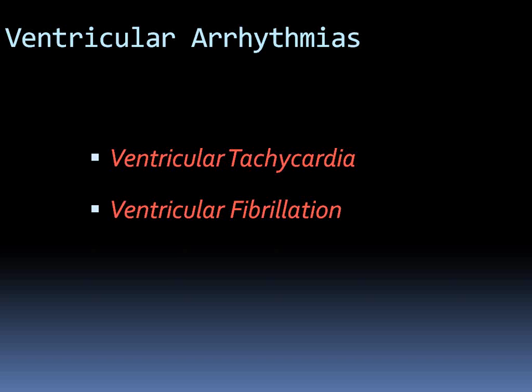The most important thing for you guys in cardiac rehab will be to make sure that the patient is not having any ventricular tachycardia, is not having any atrial fibrillation, is not in any degree of heart block, and is not bradycardic. Those are the most important things. Rhythm recognition in ACLS and acute MI recognition are the most important things.